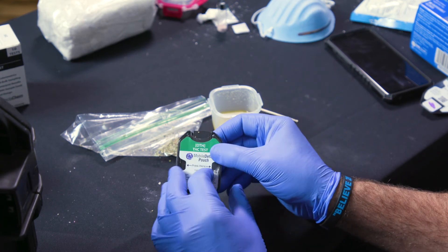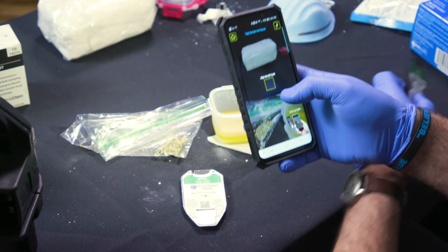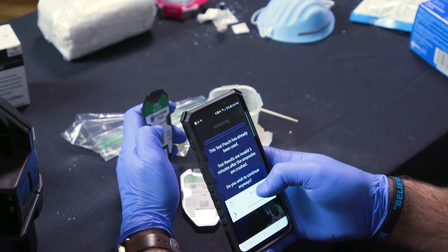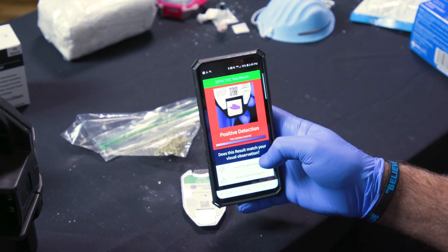So after you've waited a few minutes, or you start seeing that reaction occur, open the app. And you'll get your detection result.